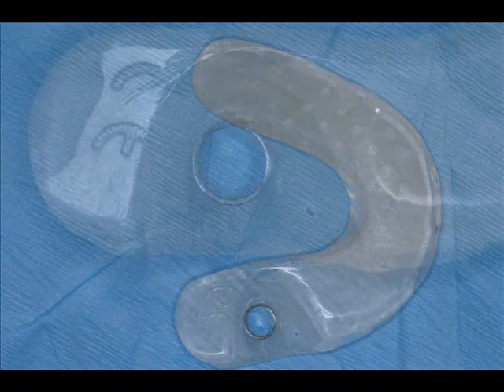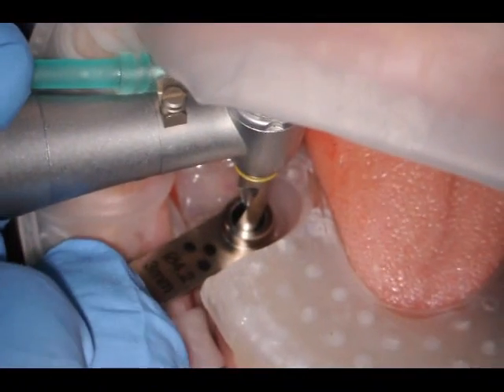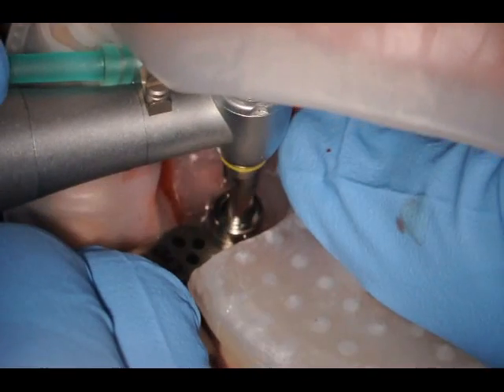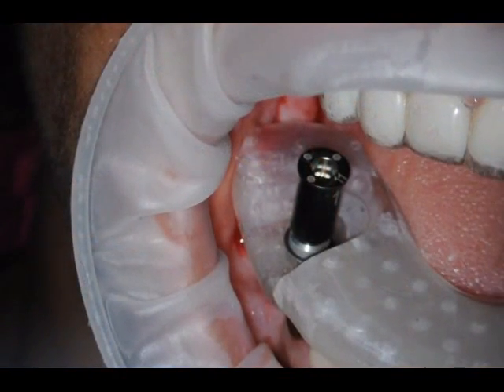What's great about this stent is that it allows me an incredible amount of accuracy and precision. You see this round sleeve within the stent, and all this is adapted to fit the patient's mouth. So we deliver the stent into the patient's mouth, and it seats very snugly on the teeth in the whole arch. And then I can follow that sleeve and place the implant exactly where I had designed it.